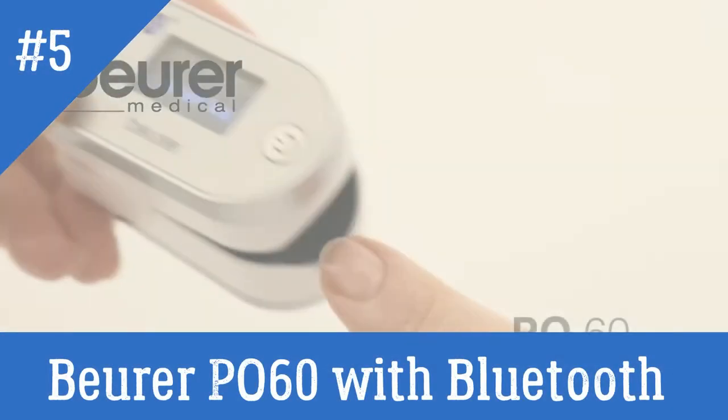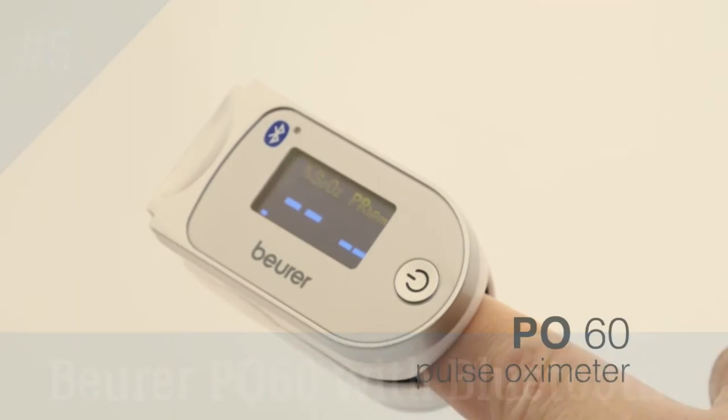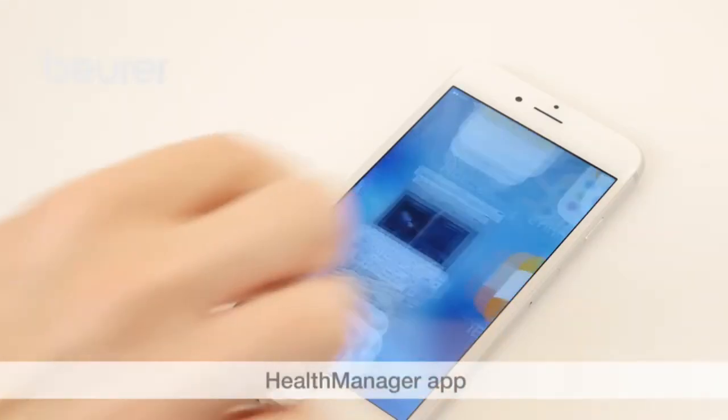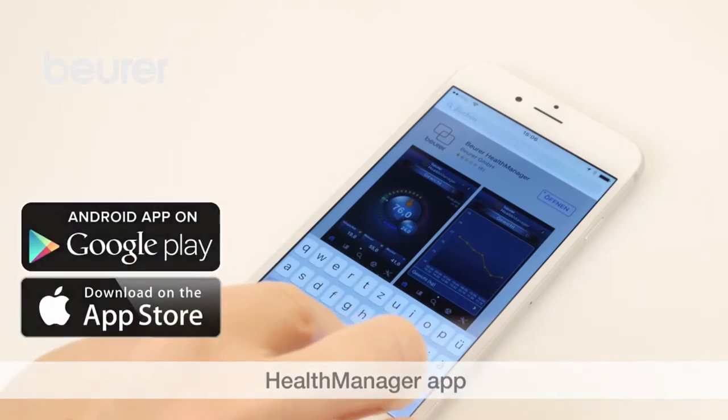Here are some tips for using your PO60 Pulse Oximeter from Beurer. Download the Beurer HealthManager app to enable full use of the PO60.